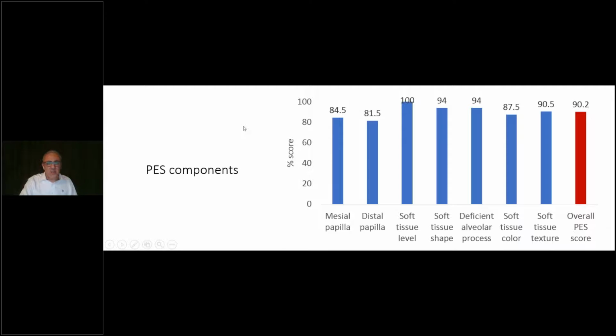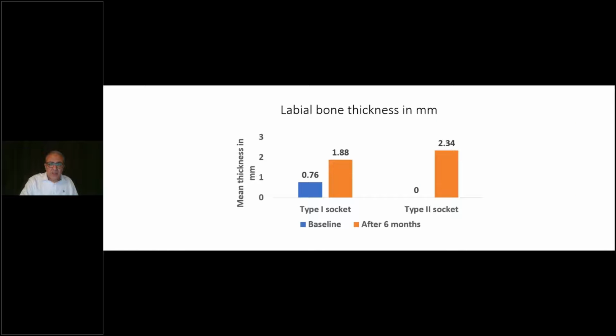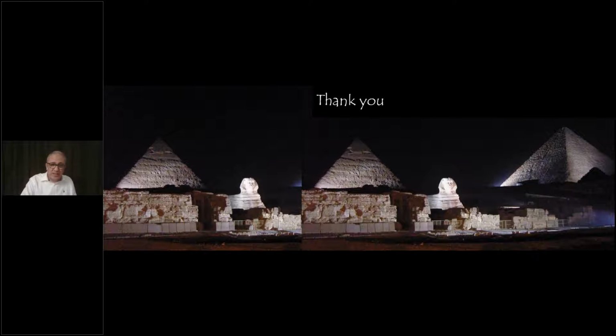The first study was 6 months. The second one is 1 year, maybe 1 year and 2 months, and we measured the labial plate bone thickness gain. And I will update you with this technique once this article is published in the JOMI. Follow this up. I think it's going to appear in June. So probably it's next month.